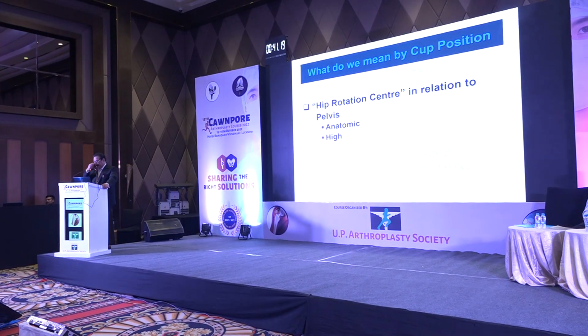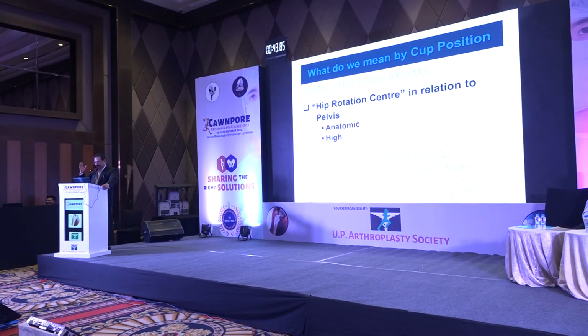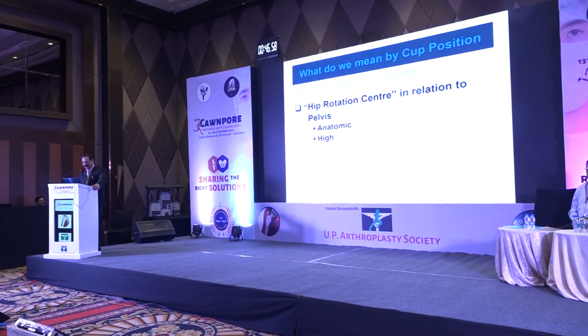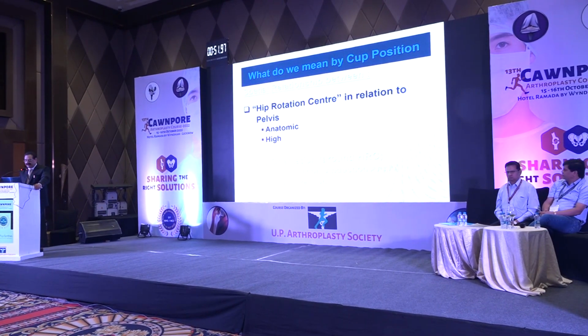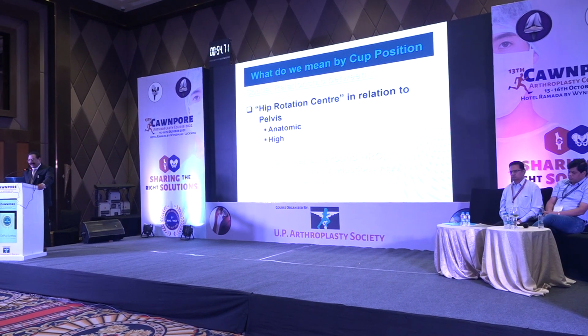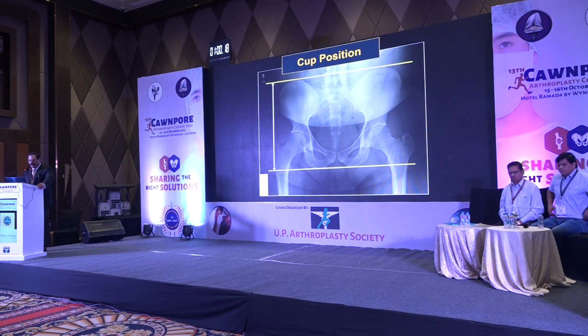When we talk of hip rotation center, it could be anatomic. I think Dr. Dhansekar has made my job very easy because he has talked about high hip center, but there will be some overlap and repetition. Hip rotation center in relation to pelvis could be anatomic or high hip center. And when we talk of anatomic, what do you mean by anatomic? Where lies the cup? So in terms of Dr. Ranawat, the cup lies in an isosceles triangle, which is about 20% of the total height of pelvis, just lateral to ilioischial line and starting at the level of intersection of ilioischial line and Shenton's arc.